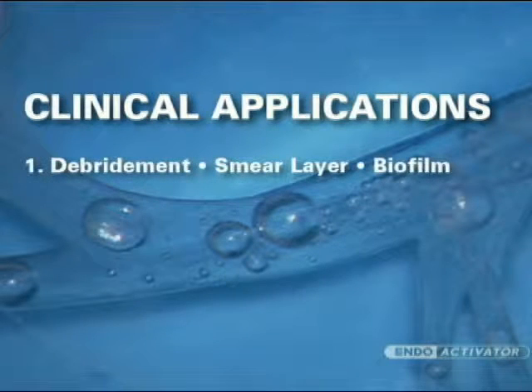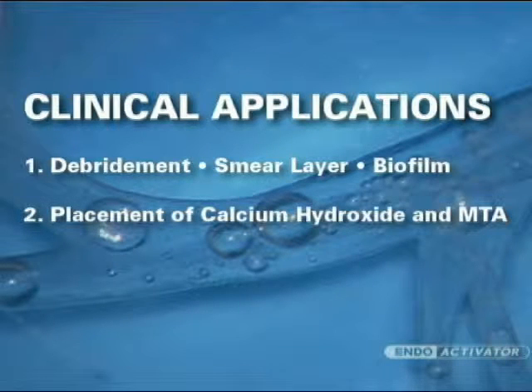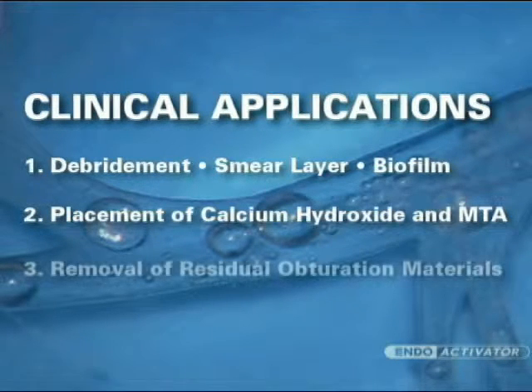Three-dimensional debridement and disruption of the smear layer and biofilm. Placement of calcium hydroxide and MTA around root curvatures. Removal of residual obturation materials during retreatment procedures.